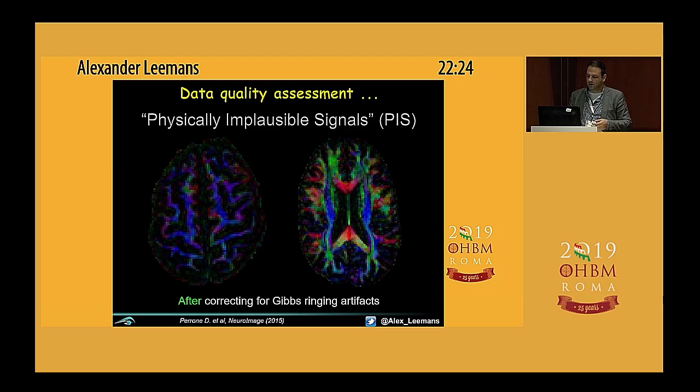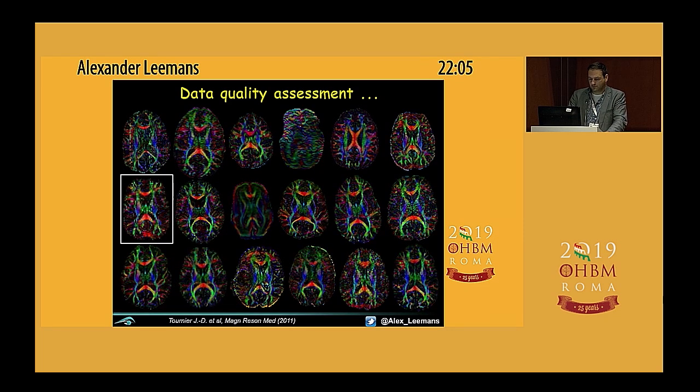So we used an off-the-shelf total variation filtering. It's a fancy nonlinear filtering approach, but it was already existing in the 90s, right? So we didn't do anything new in terms of methods development. We just found an easy way to fix it. And there are now more approaches to deal with Gibbs ringing. Okay, let's move on to the next one.